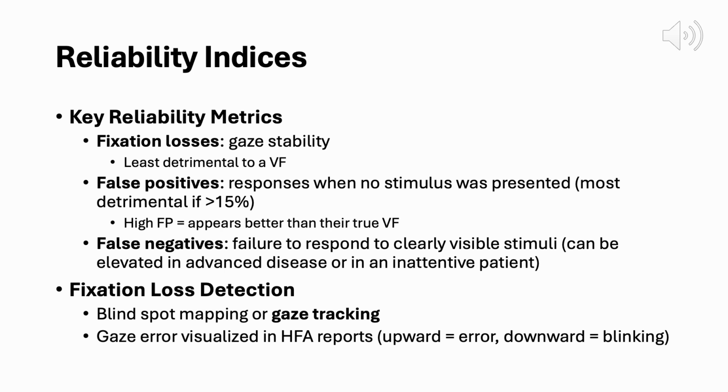False negatives are when the patient fails to respond to a bright stimulus. This can indicate poor attention, fatigue, or advanced disease. It doesn't always mean the test is unreliable, it just needs context.